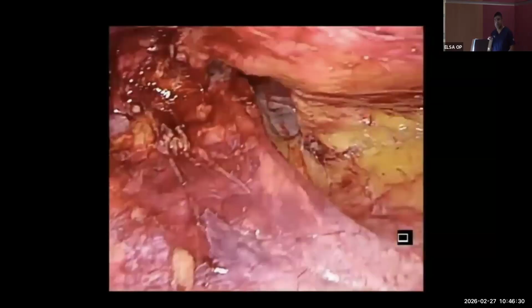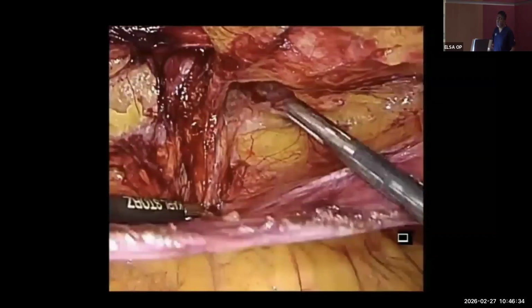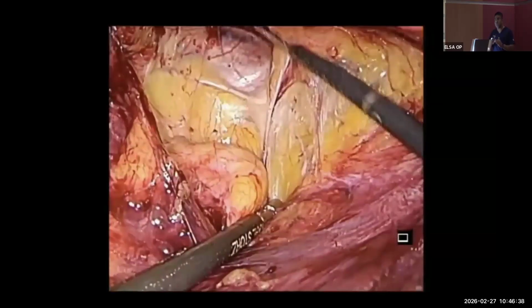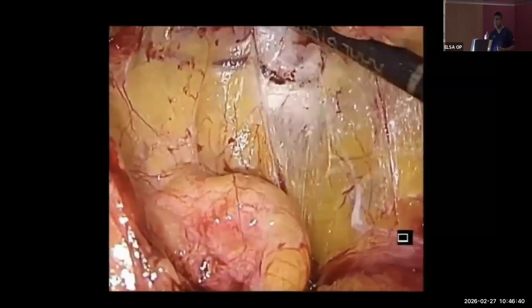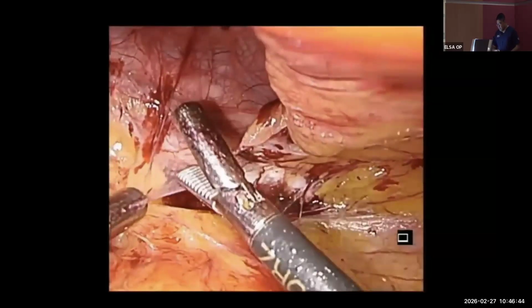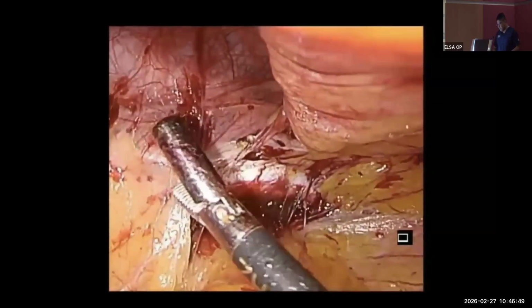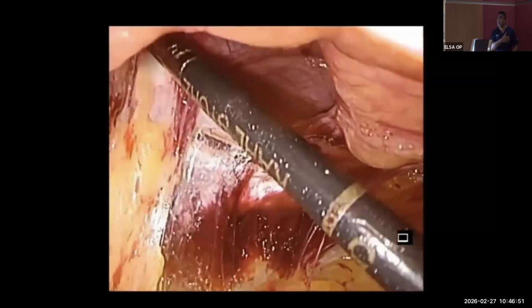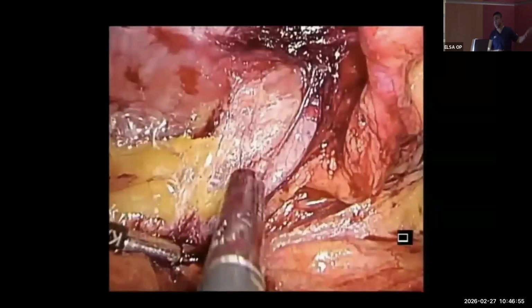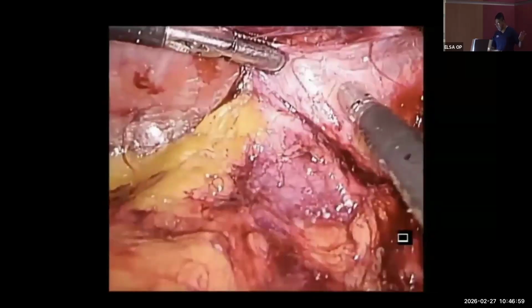The only difference, if you're going to do an eTEP for a large inguinal hernia, is you go beyond ASIS and cut the peritoneum, because you do this before you open the peritoneum to reduce your contents. So this is a direct hernia being reduced, and you saw for TAPP, we started laterally. So dissection goes from lateral to medial in TAPP, medial to lateral in TEP.